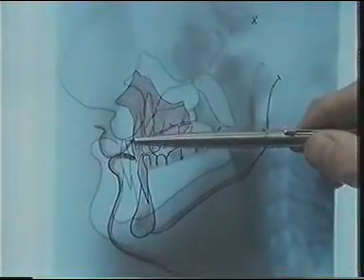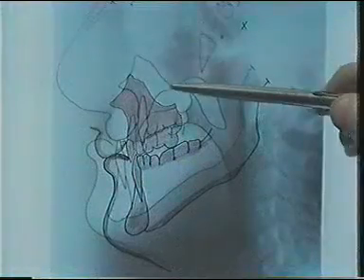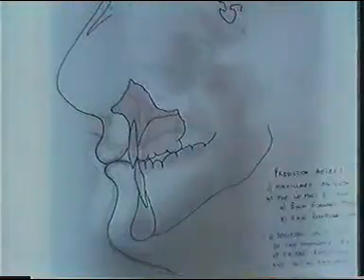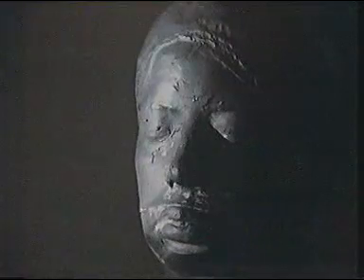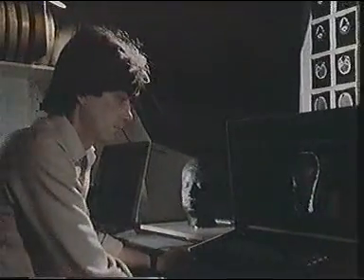This procedure is very difficult because a face is a three-dimensional object and the X-ray is only a flat representation. Nearby at the Slade School of Art, a powerful mini-computer will soon help this process. From this demonstration head with a real skull inside, a model is produced by the computer which uses data taken from these special X-ray pictures. Real patients will be scanned by harmless beams of light.